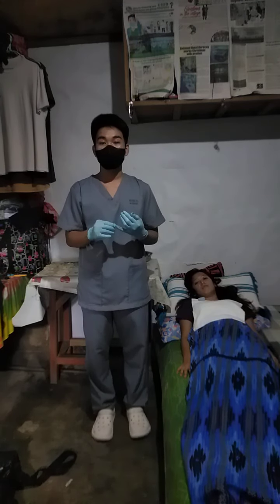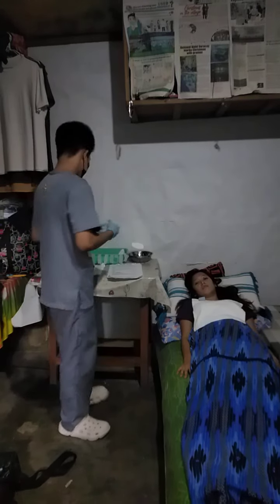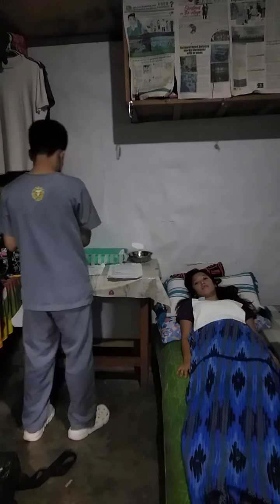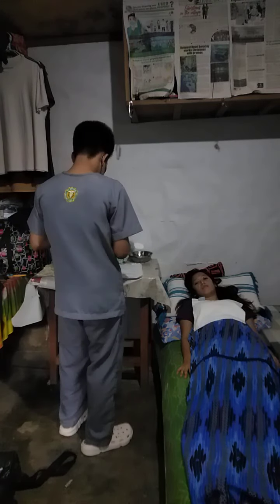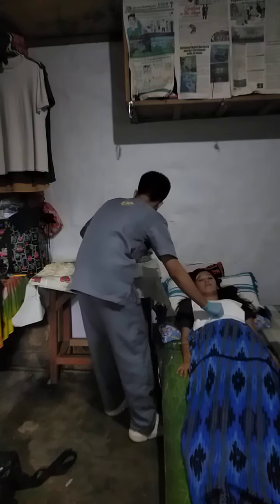This ensures that the tube will be long enough to enter the patient's stomach. Nostril. Then mark.